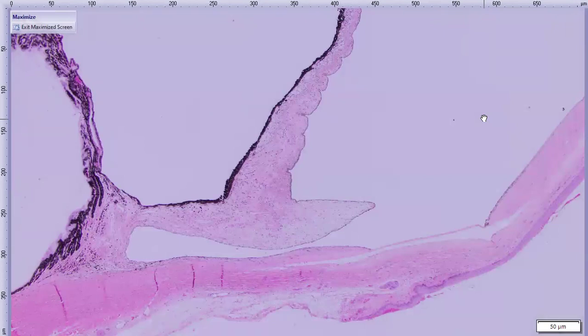And then in particular, the big breaks in Descemet's membrane coupled with the distortion of the anterior uvea, potential displacement of the iris base and ciliary body from their normal anatomic location with fibrosis in the gap, like we kind of see here, this kind of suggests to us the sequela of cyclodialysis. So we would wonder if at some point the iris and ciliary body tore away from their normal location, and then what we're looking at here is the chronic consequences of healing after that event.